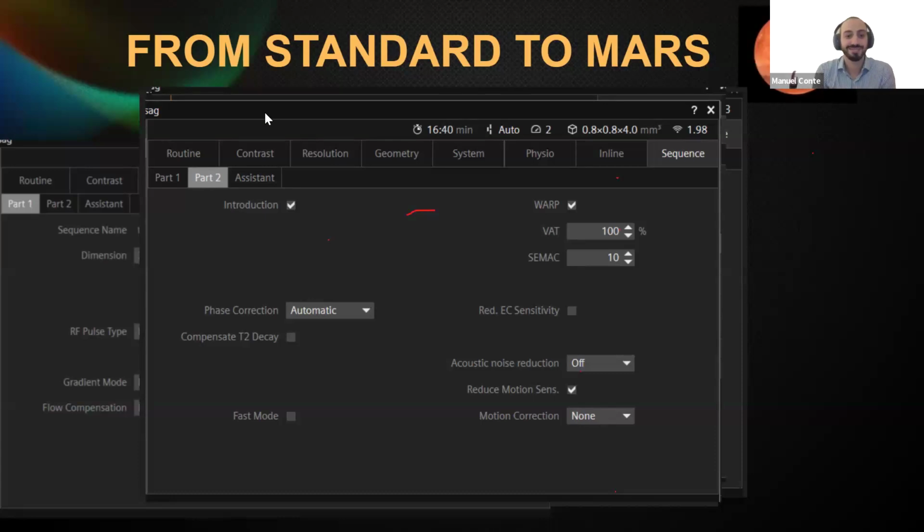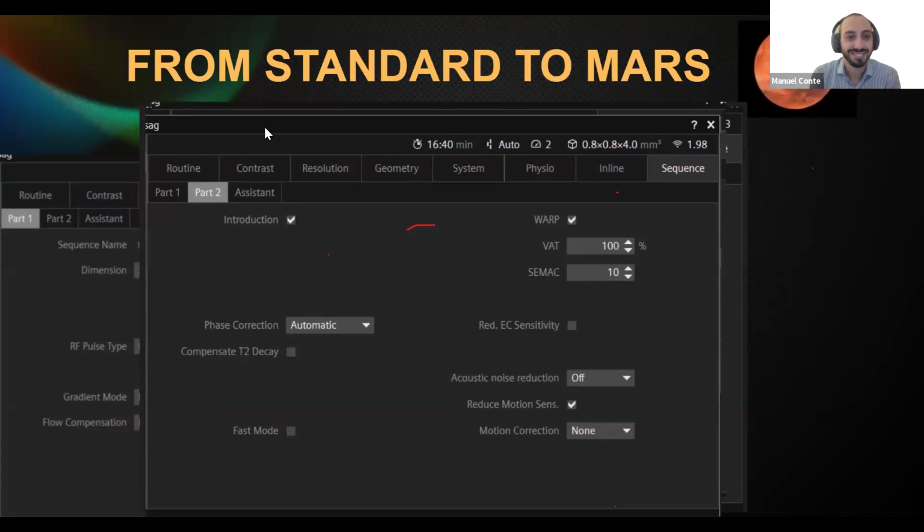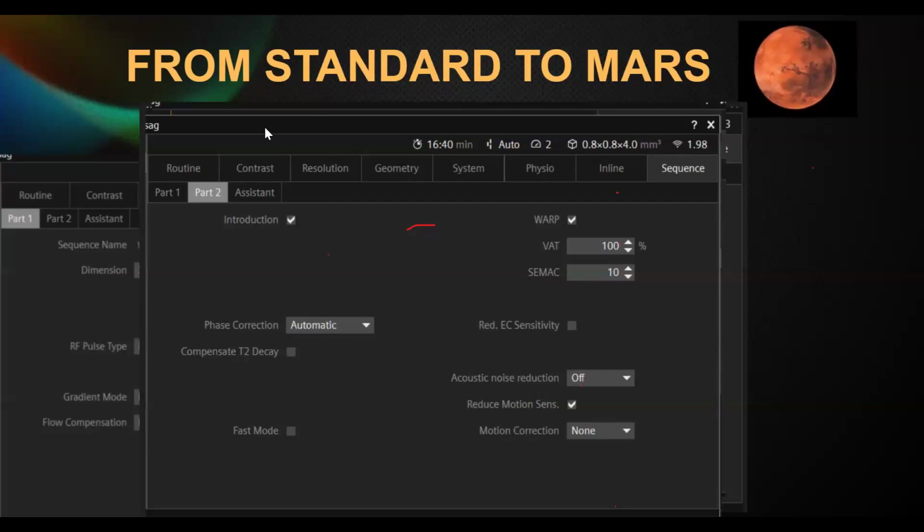Hi, Patricia. So my question was about flip angle. I can't remember where, but I was taught that you can hopefully reduce the heating effect by reducing the flip angle. What were your thoughts on that? No, I definitely agree about that.